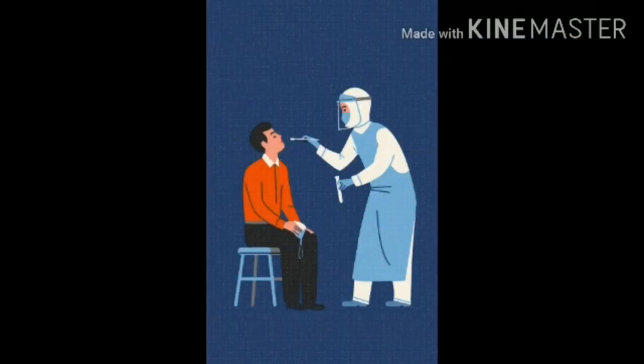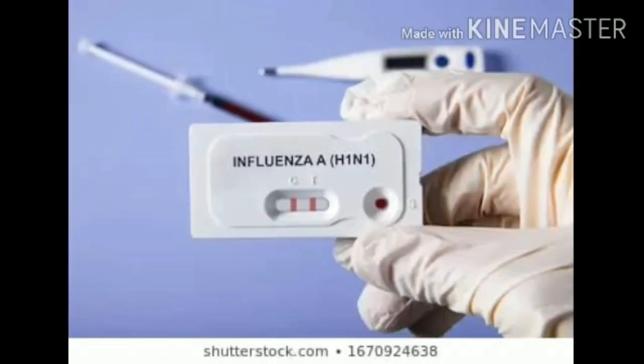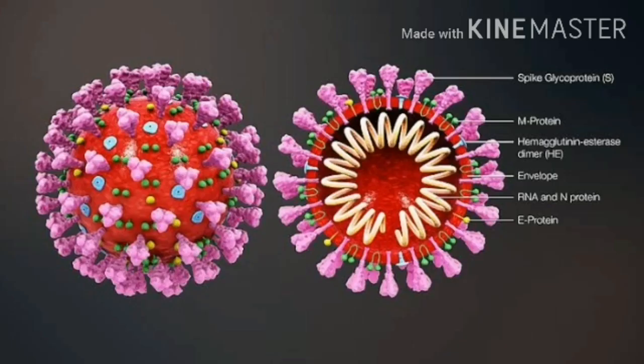Let's begin with the nasopharyngeal swab. The patient should be alert and cooperative. Allow them to first blow their nose. The patient should sit in a relaxed and comfortable position during the sample collection process. Tilt the patient's head back slightly and support it with your non-dominant hand. If necessary, lean the patient's head against a wall to minimize jerky movements.